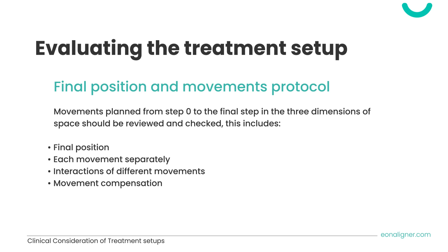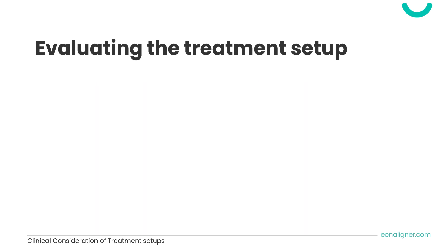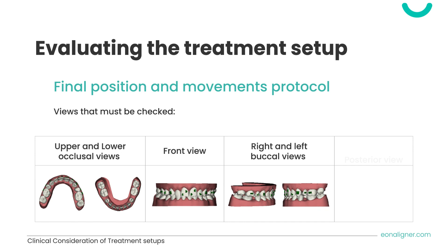The final position needs to be evaluated carefully from the beginning to make sure treatment goals are met and the final result is aesthetically and functionally acceptable. Next, we check how those final results were achieved by evaluating each movement separately, interactions of different movements, and any expected movement compensation. The views that need to be checked are the upper and lower occlusal views, the front view, right and left buccal views, and the posterior view. Always follow this systematic approach to ensure no detail is missed.